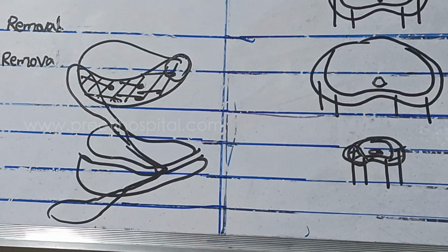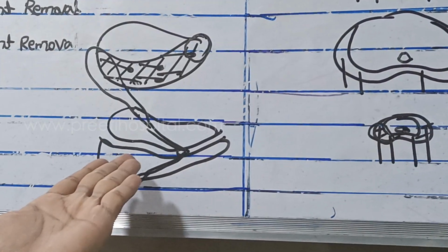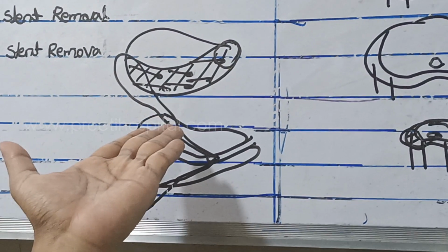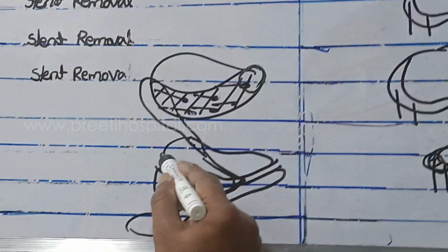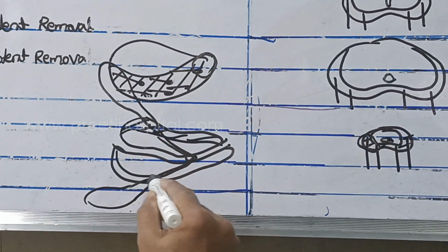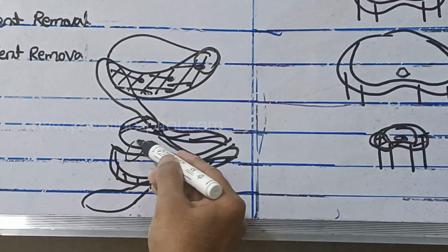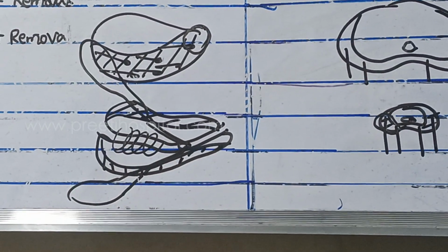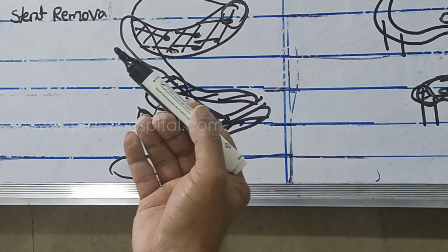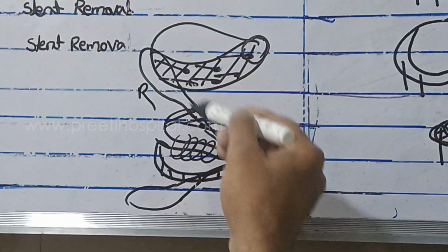Rectum side. So which is the first structure seen? Seminal vesicle. Next structure seen is the posterior part. Next structure is the anterior part. So in both regions, this part is the peripheral zone. What do you say, Sandhya? Yes. And this part is the transitional zone. Here, if you go up with the probe, you will target the patient's right. For example, if this is the patient's right, you will go up, you will target here.